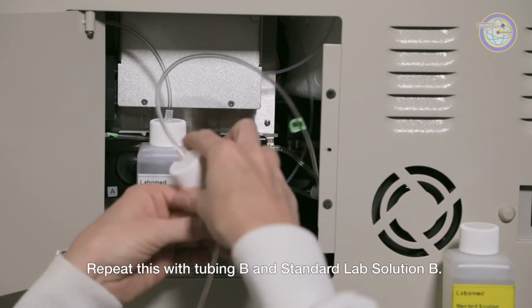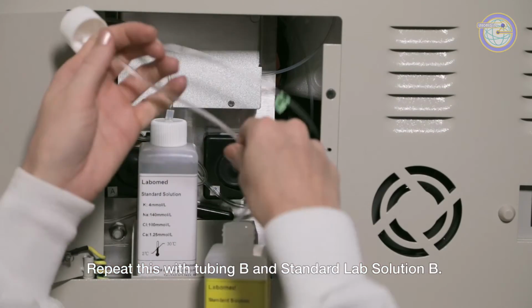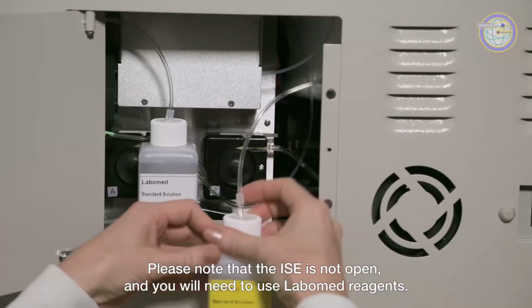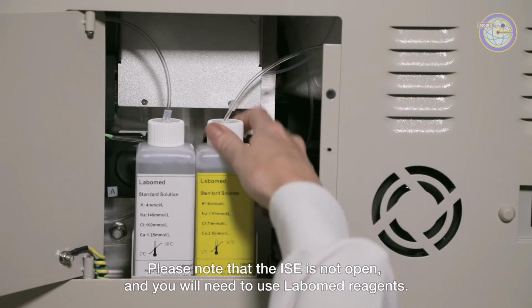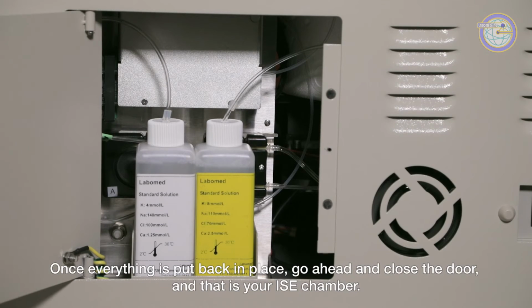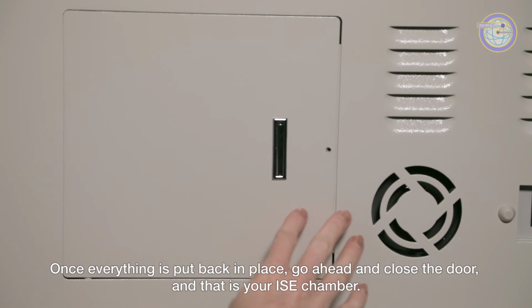Repeat this with tubing B and standard lab solution B. Please note that the ISE is not open and you will need to use Labomed reagents. Once everything is put back in place, go ahead and close the door. And that's your ISE chamber.